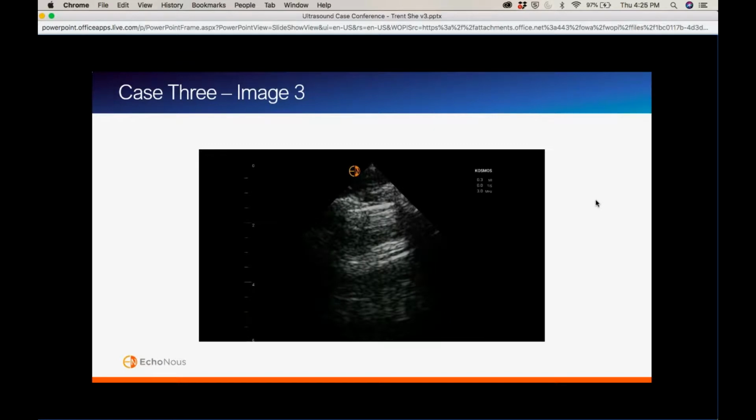I don't think if you had put in a chest tube or needle decompressed both sides because of the absence of lung sliding in a tall, thin male in cardiac arrest, you would be faulted at all. That would be the natural next step.